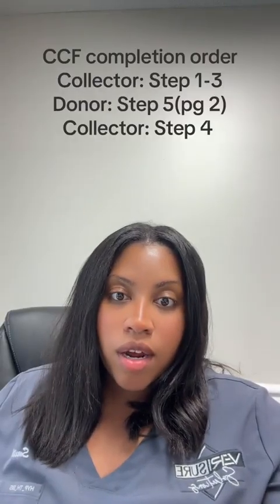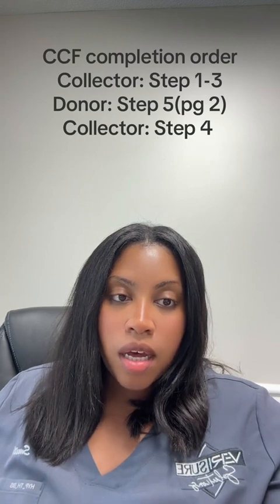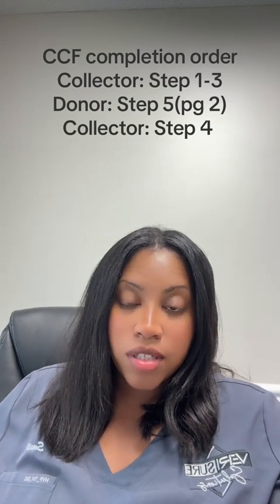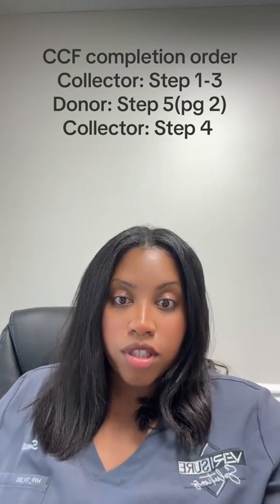You as a collector are then going to complete the CCF. So step 1, 2, and 3 should have already been completed at this point, and then the donor just completed step 5, and you as a collector are going to go back and complete step 4 in full. Print, sign, date, put the time, and who the label is being shipped by. So if it's Quest, FedEx, whoever you're shipping it by.